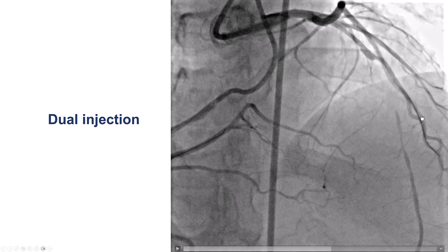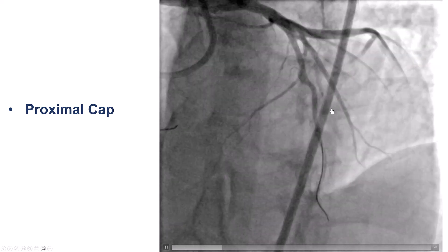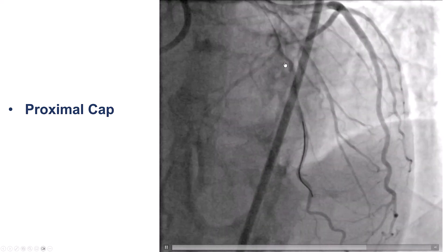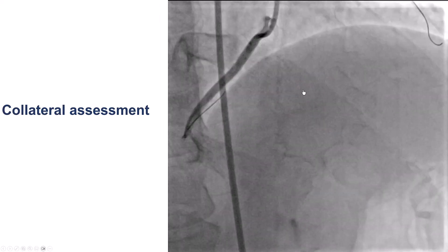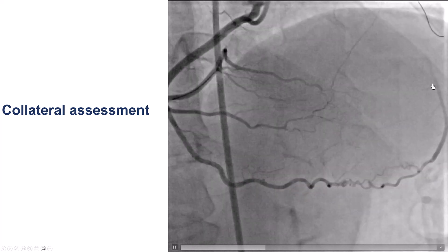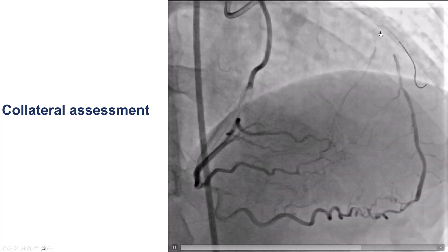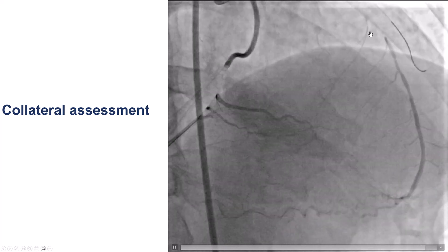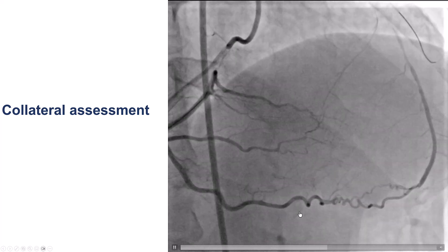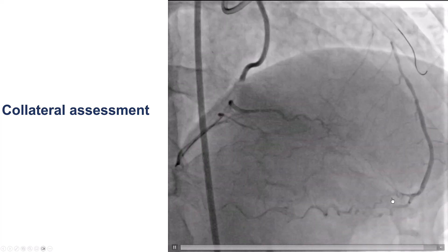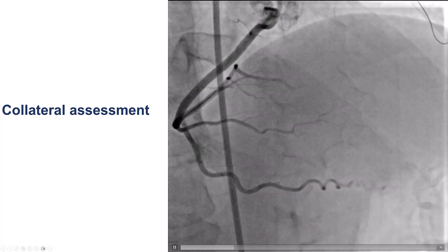The distal vessel is filling through epicardial collaterals, mainly from the right coronary artery. In the leocranial view, we can see where the stump is, but it is fairly blunt. When it comes to the collaterals, we do have some septal collateral, but this is going very close to the distal cap, so not very useful for crossing the CTO. The epicardial collateral coming from an acute marginal branch is extremely tortuous, and probably not optimal for doing retrograde.